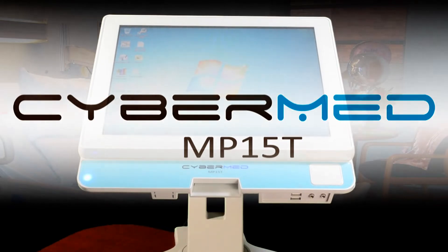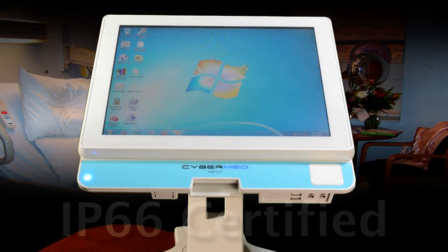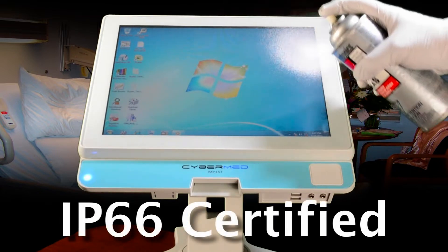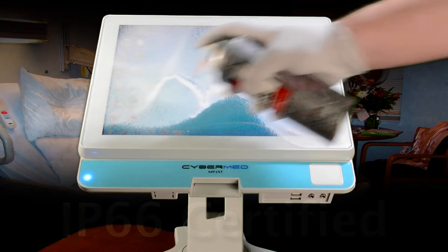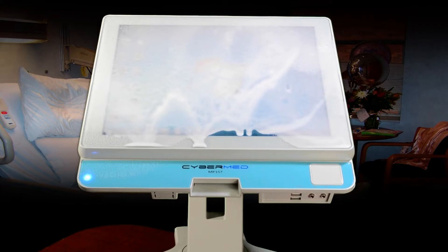The CyberMed All-in-One Medical Computer has a waterproof front bezel certified in accordance with the IP66 standard. That means you can spray the front of the PC with cleaning solutions and wipe it down without damaging the PC or its internal electronics. This is really important for healthcare facilities because it helps maintain a hygienic environment.